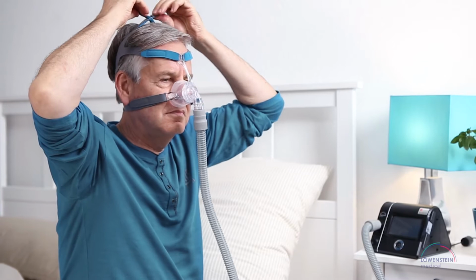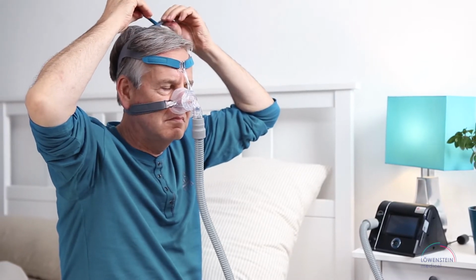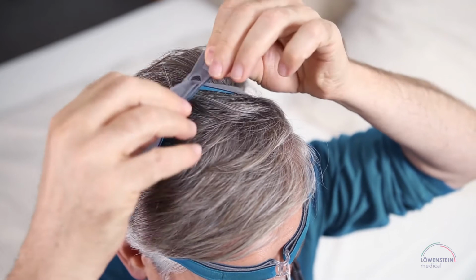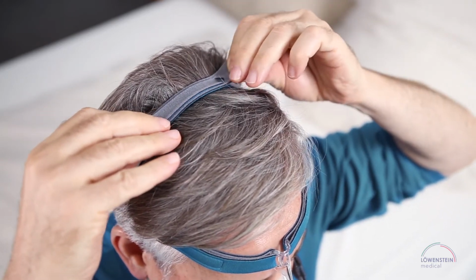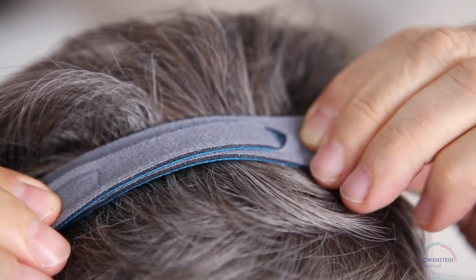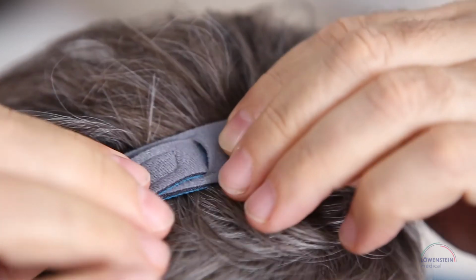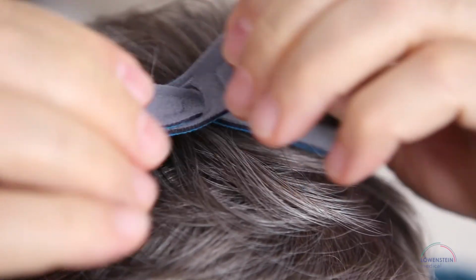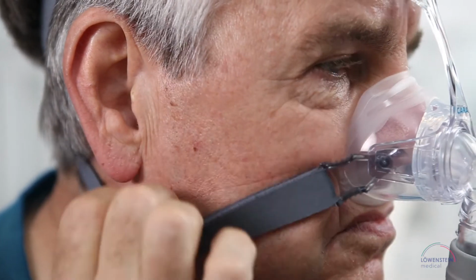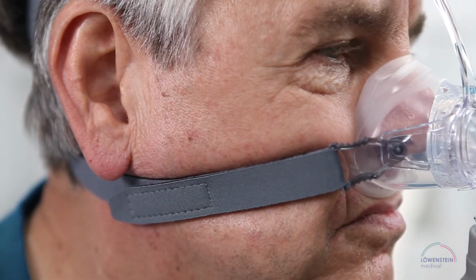With the newer version of CARA, you can adjust the cross strap on the head in such a way that the lower straps do not sit too close to the earlobes. To do so, loosen both hook and loop tabs. For a small head, pull the tabs apart, and for a large head, push them together. With these options, you can adjust the size of the headgear ideally for your head circumference. Make sure that the lower straps do not touch your earlobes, but lie loosely under them.